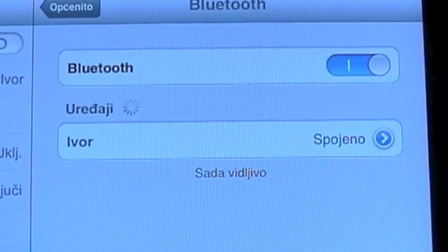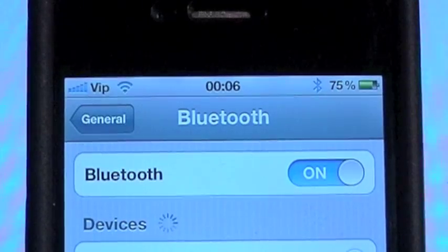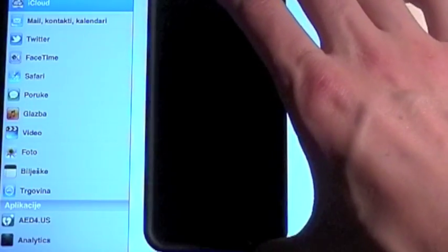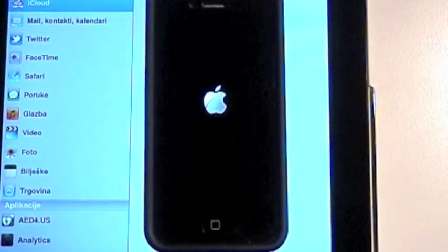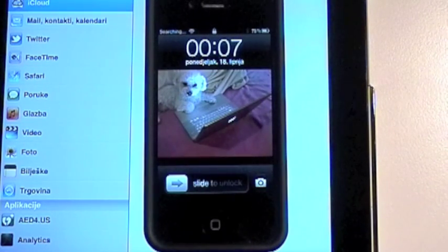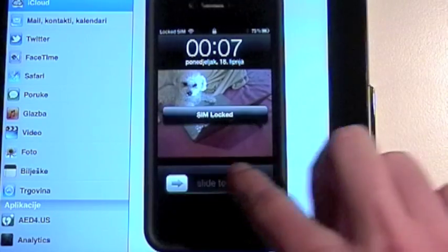Before connecting the two devices, make sure that the Bluetooth is turned on on both the iPad and the iPhone. We recommend restarting your iPhone but leaving the SIM locked. In that manner, you will still have your wireless connections available but not be distracted by incoming calls or messages.